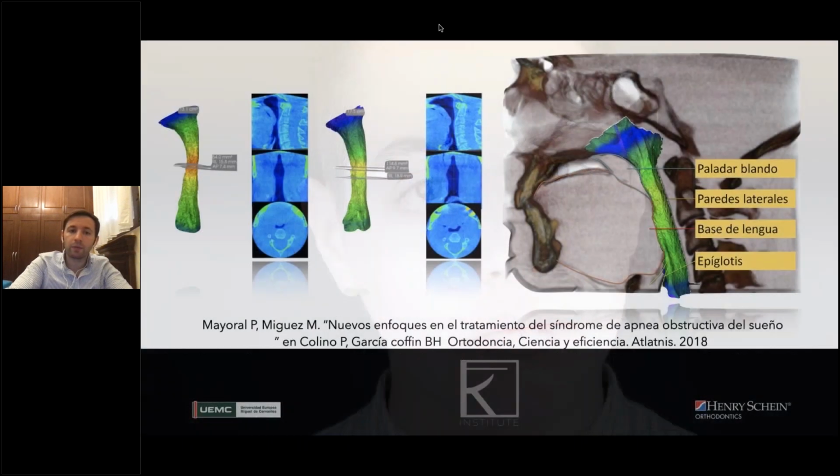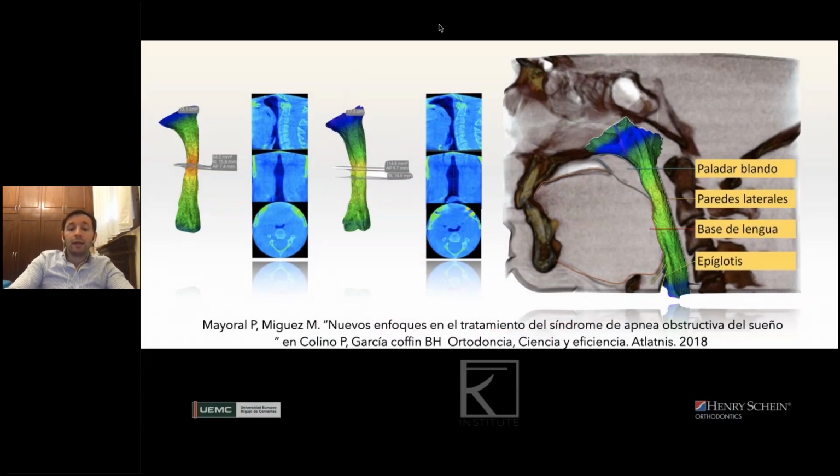This is the patient after that, after 3 months. So the technology is necessary in order to diagnose the position of the jaw. The technology for sure is important, it is the key to diagnose a volume problem.